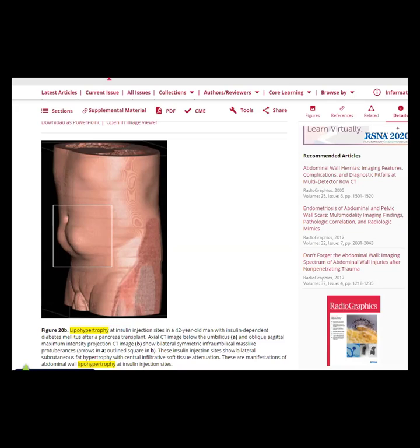But what are the surrounding tissues, the fat? That's the question. Yeah, that probably is. I don't know how to answer that. Anyway, it's just something to keep in mind if you see that going through: this is what it is. Abdominal breasts.